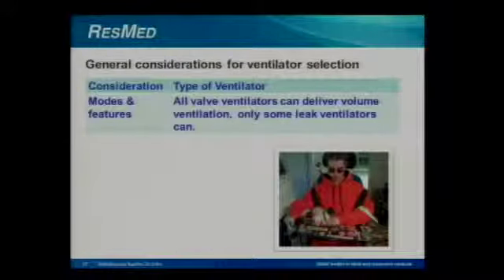Now this is one of my dear patients. We've been looking after him for almost 5 years. He's on a mouthpiece ventilator. And just like Dr. Bendit says, we need him everywhere in the country. I come from Indiana, so we don't have a lot of expertise with mouthpiece ventilation there. They wanted to trach him because they didn't think there was any other option. But we talked him into trying it.